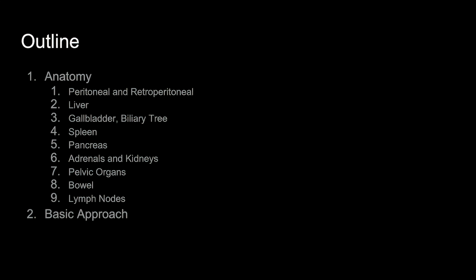In the second video, we'll talk about the things that you'll commonly see, the things that you should never miss, and some clinical pearls that are going to help you deal with common clinical situations.